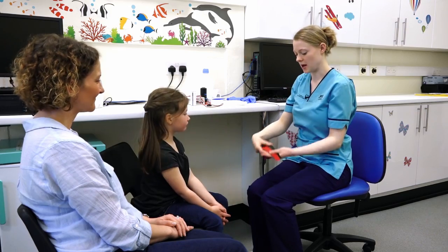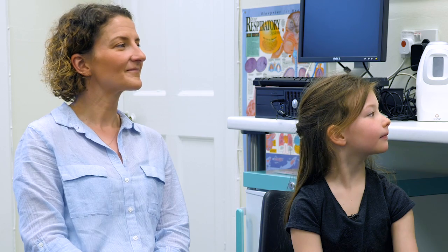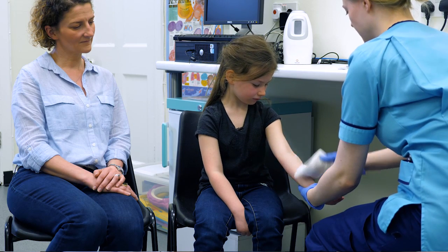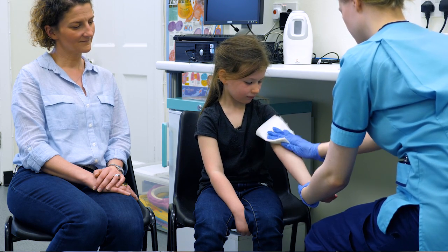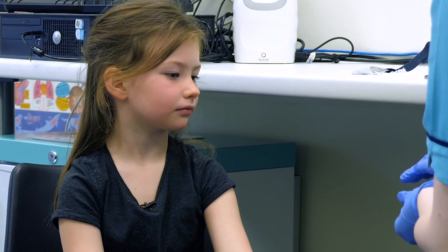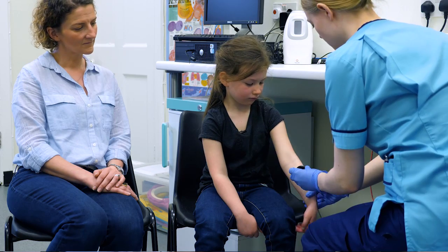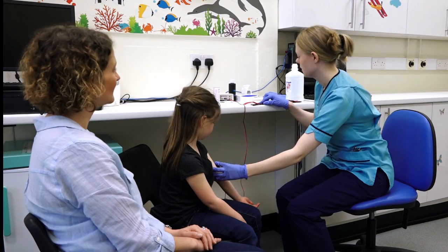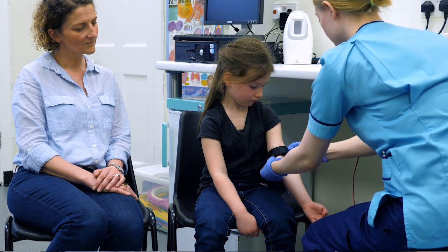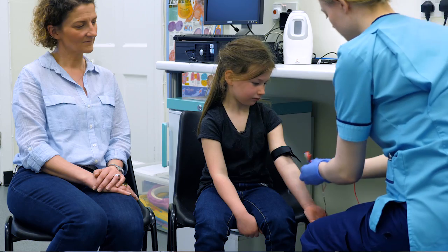So we're going to put these two bands onto your arm, but first I need to wash your arm. And I need to put my gloves on as well. Then I'm going to put this jelly on. I'm just going to put this one and turn your arm round again. I'm going to put this one up here and then this is just going to hold it on nice and tight. And then this one goes down here.